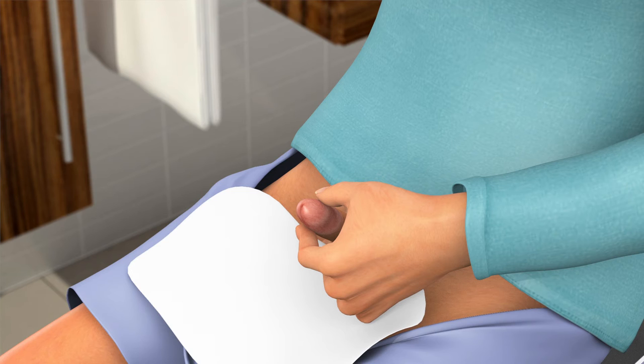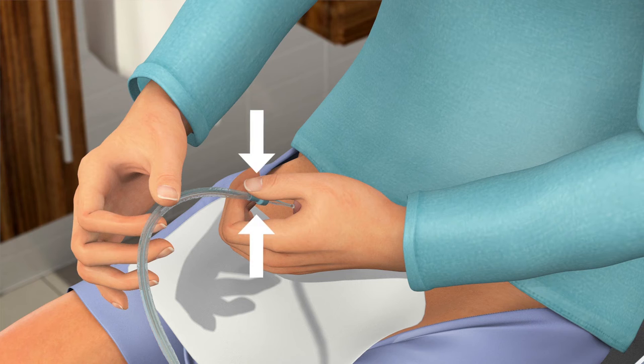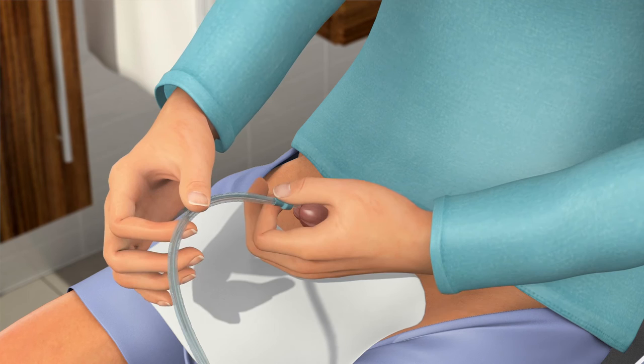To control insertion, softly squeeze the gripper indicated by the arrows. While supporting your penis, guide the tip of the catheter into the opening of the urethra.